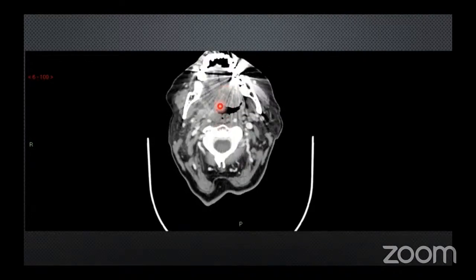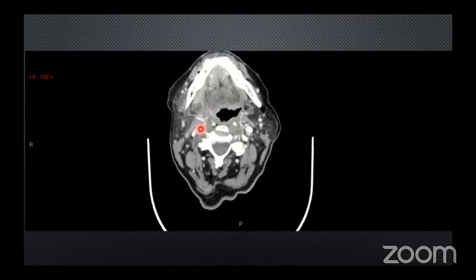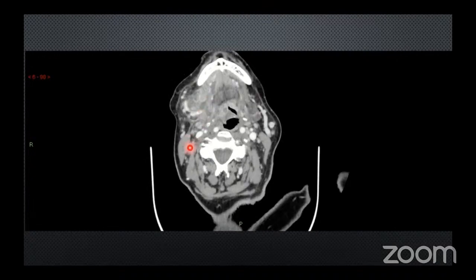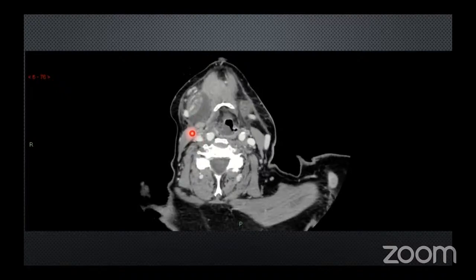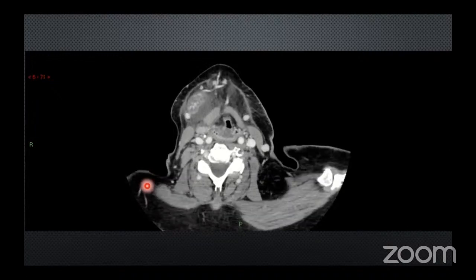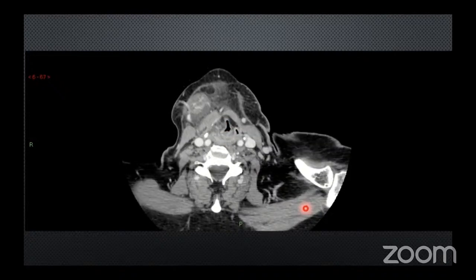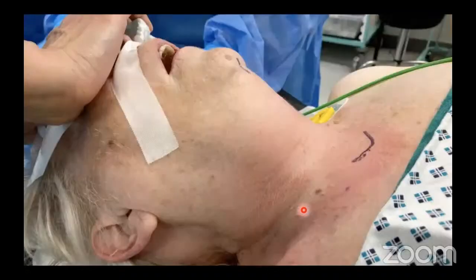She has significant involvement even to the glossotonsillar sulcus area, coming down into the sublingual and soon the submandibular space, as you'll be seeing soon here, with displacement of the submandibular gland medially and inferiorly. It's a big facial vein here. The most important thing here, however, is to see how the airway is becoming more compromised. Although there's no direct extension of abscess into the airway, she has significant supraglottic edema.